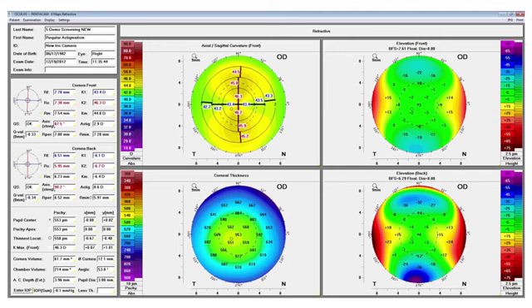This is an example of a patient with regular astigmatism. On the curvature map you see the nice symmetrical bow tie-like shape. On the elevation maps you see truncated figure 8-like pattern, and on the corneal thickness map you see good corneal thickness. The display also gives you several measurements such as keratometry, pachymetry, anterior chamber information, and horizontal white-to-white measurement.